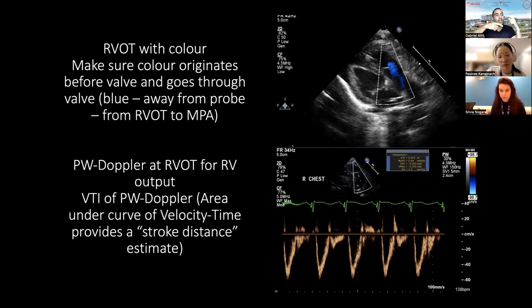swirling effect. So think of the blood like being ejected through a turbulent path. What's going to happen? It's going to start swirling. It's going to start turning like a snowball. So then you're going to have blood flow coming towards you, going away from you. So in order to really clean out what's the average directionality of your blood flow, sometimes you need to increase this velocity filter, or decrease the velocity filter if you have very low velocity structure.